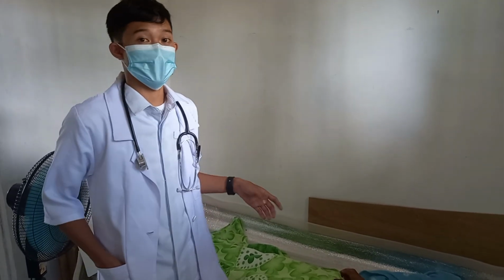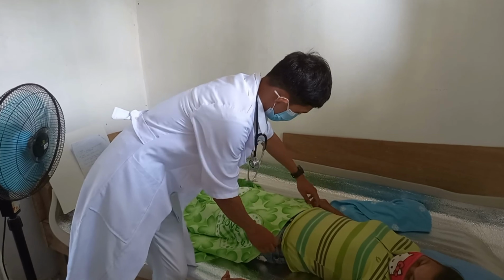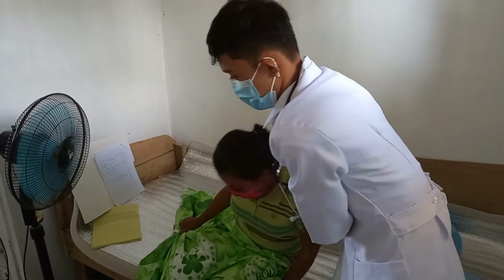And now I will help the patient to cover the exposed area of assessment. And I will help the patient to sit properly.